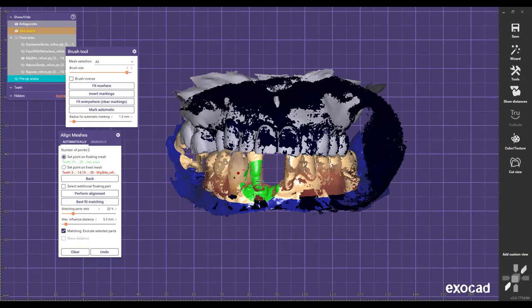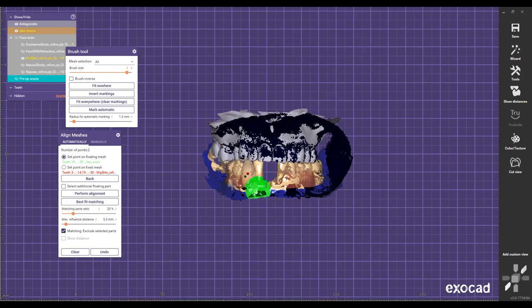There's nothing on the market right now that you can use as a bite scanner, especially a facial scanner, right? So we have proprietary techniques and workflows that are very unique and different from what's on the market right now. And a lot of doctors that are using technology like photogrammetry get the benefit from us by integrating this type of technology in their practice and combining them with iCam, PIC, MicroMapper, all these technologies, so they can improve their workflow. So that's something that we bring to the table.